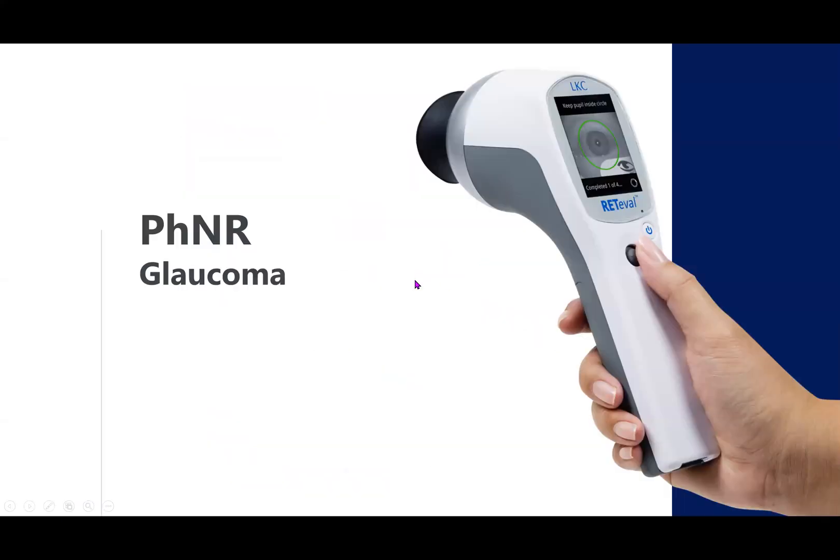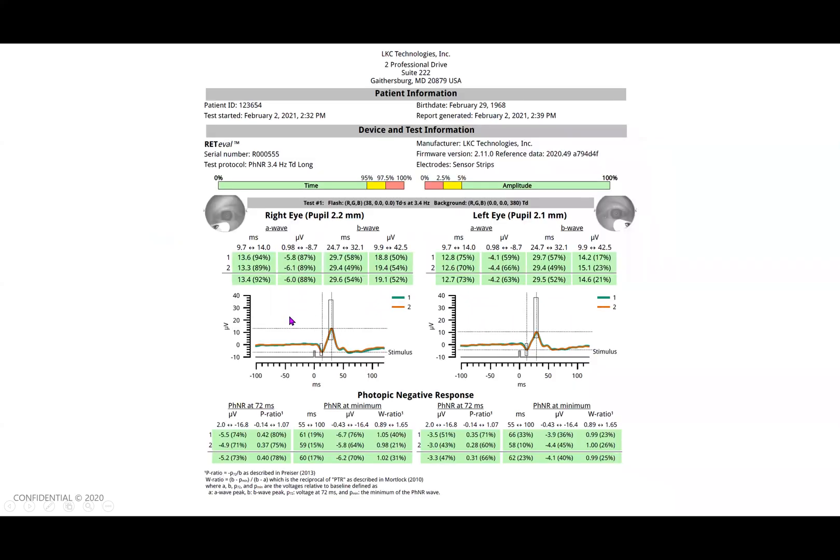The next test is the photopic negative response, which is a test that's generally used for glaucoma. You can see here waveform looks a little bit different. The first two tests use a high frequency flicker or high frequency flash. And it doesn't really give the retina a chance to recover after each flash. So you see a different looking waveform, more like a roller coaster. This test has a lower frequency flashing, giving the retina a chance to recover after each flash. So you get a more traditional A wave, B wave, PhNR.